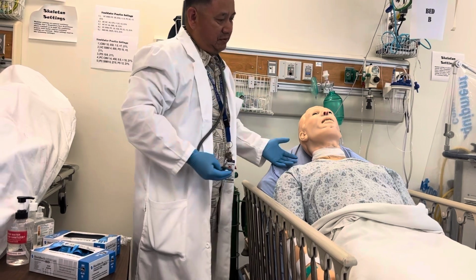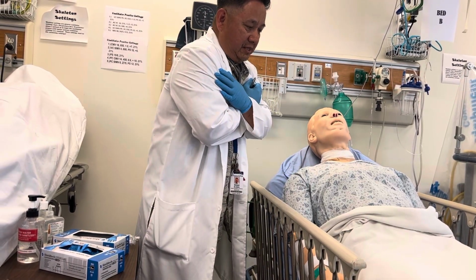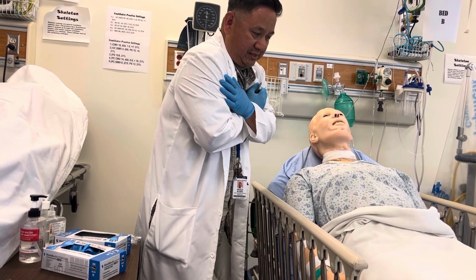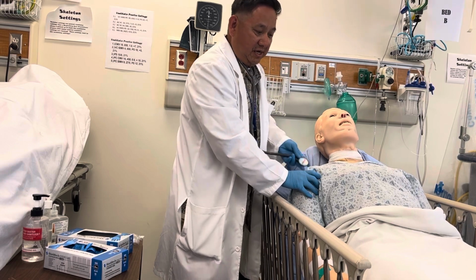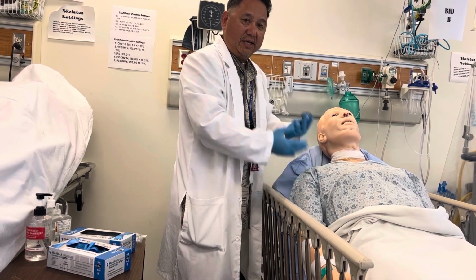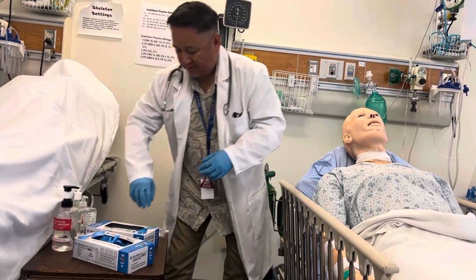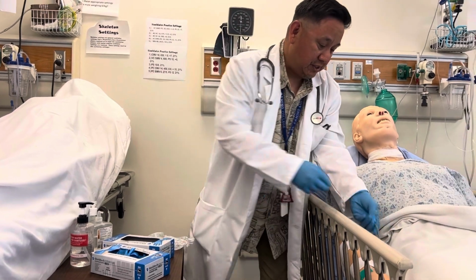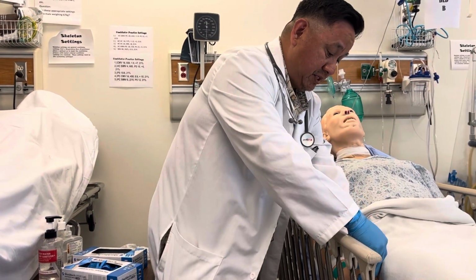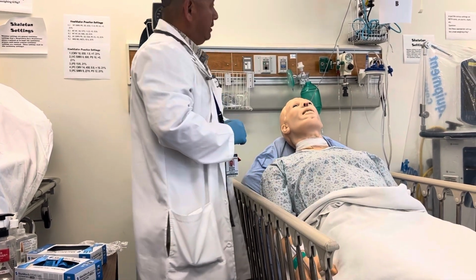If the patient is able to sit up, I will direct them to lean forward and cross their arms over the chest. This mannequin is not able to, and I will proceed to auscultate, starting from the bases and upwards. I would also check his saturation via the pulse ox. Good.